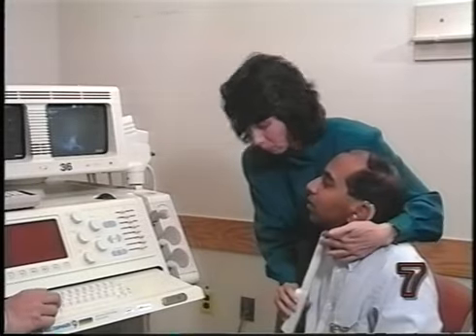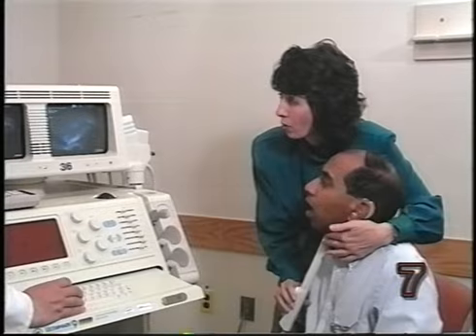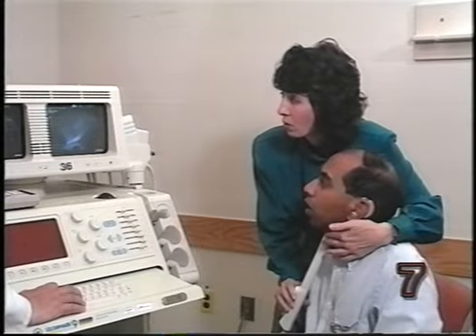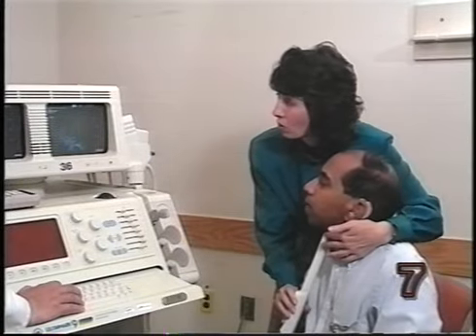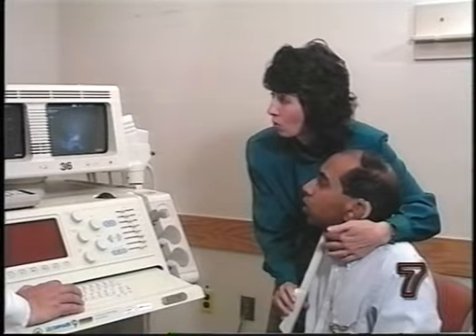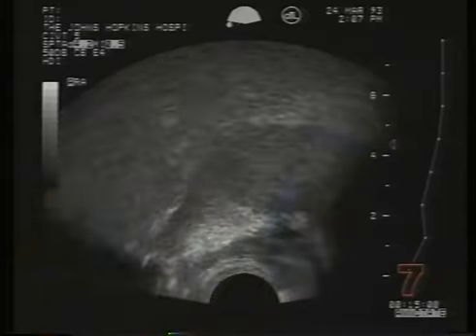One of the obvious applications for a system like this, where you get visual information of previously hidden behaviors, is biofeedback. So a person who has hearing impairment or another speech disorder can now see the movement of their tongue, whereas before they had to rely on hearing the output.